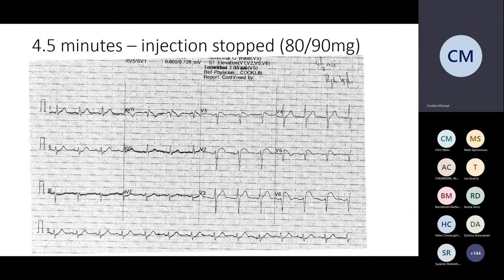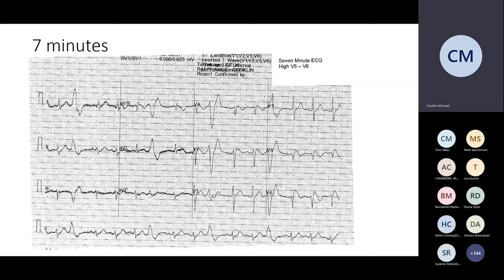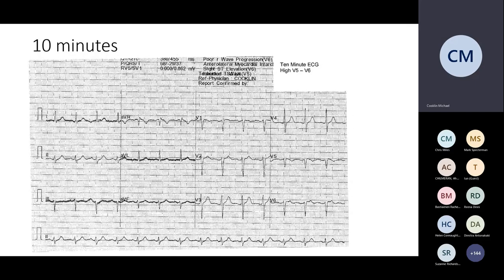At about 4.5 minutes into the injection, where most but not all of the ajmaline had been delivered, the test was terminated due to the characteristic Brugada pattern. But fairly soon afterwards, ventricular ectopy was seen, and you can see the rather nasty, very wide left bundle type morphology ectopic beats, presumably arising from the right ventricle, possibly the free wall, with very wide QRS, probably due to slowed ventricular action potential propagation in the face of sodium channel blockade. Fortunately, this ectopy did not progress and fairly rapidly disappeared. By 10 minutes, the ECG had returned towards, though perhaps not quite, to baseline.